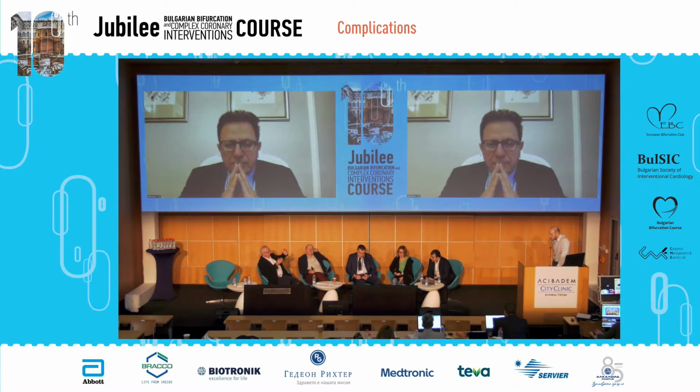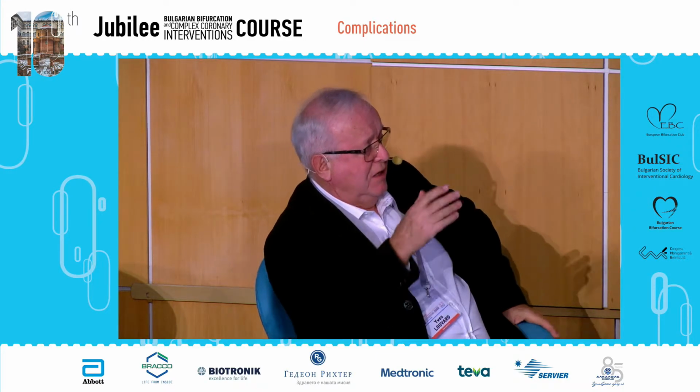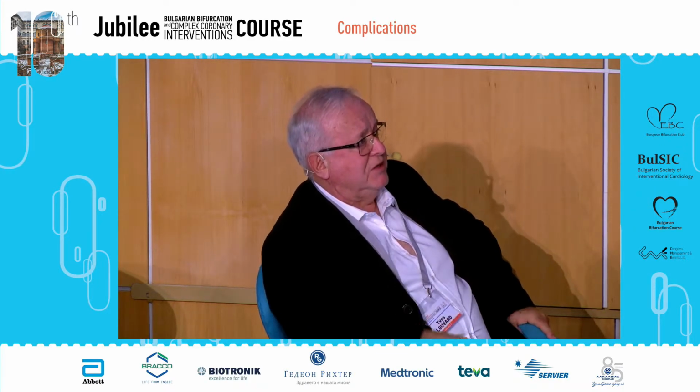Distally. So when you arrive with the stent proximally, you are pushing some blood, and sometimes you increase the dissection. Personally, I would have put the first stent distally. Distal to proximal.